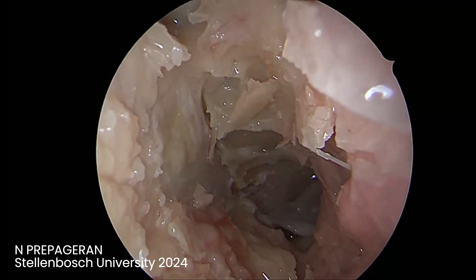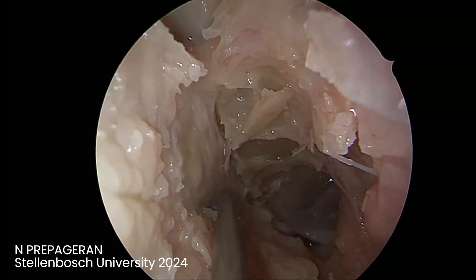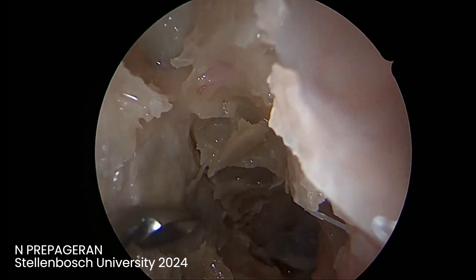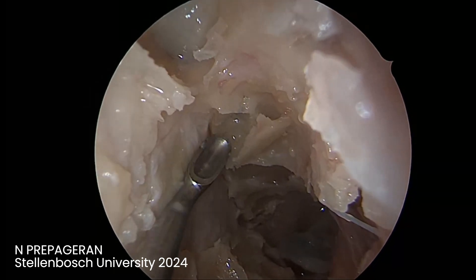I'm going to now remove and decompress the floor. Let's dissect the bone from here.